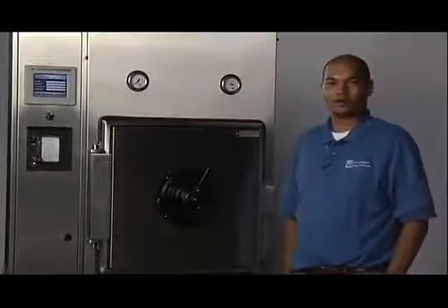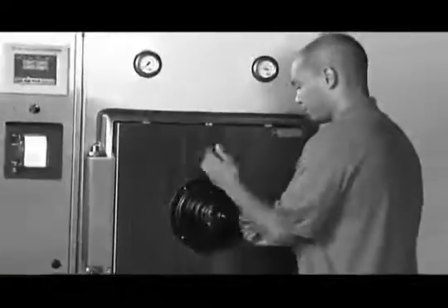Welcome to Consolidated Sterilizer Systems instructional video series. My name is Trevor Altman, and in this video we will be showing you how to properly tighten the door on your SSR 2A as well as the SR 3A model sterilizers.